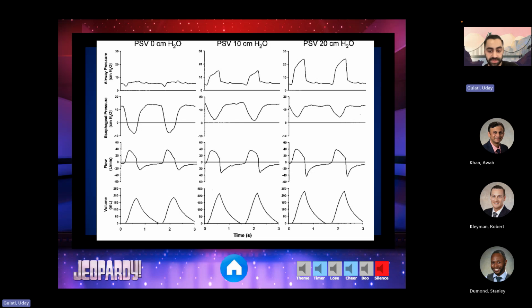The whole goal of pressure support is to provide some respiratory support and decrease the amount of work the patient has to do. When comparing pressure support to pressure control, they're both using pressure to assist your breathing, but the waveforms look completely different. In pressure support, the pressure-time waveform shows that negative pressure deflection at the start of each breath, meaning the patient is triggering the breath. In pressure control, the pressure-time waveforms are consistent. We saw that square waveform, the set inspiratory pressures will be the same every time, and you won't get that negative deflection because the ventilator is controlling the rate and timing of the breath.